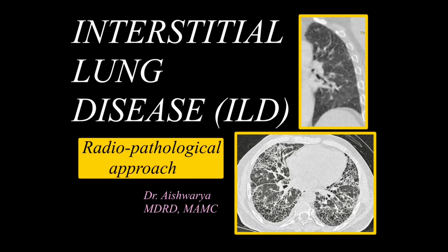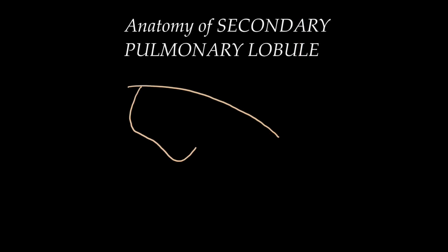We are going to learn about interstitial lung diseases and their radiological appearance, mainly using CT, and we'll also see pathology associated with interstitial lung disease in this video. Before we move to the disease, first let's know the anatomy of a secondary pulmonary lobule.